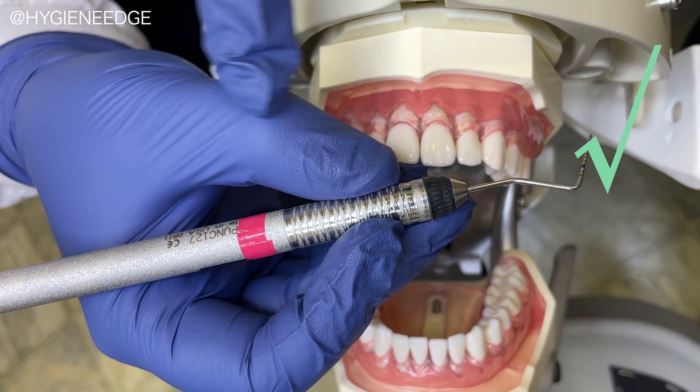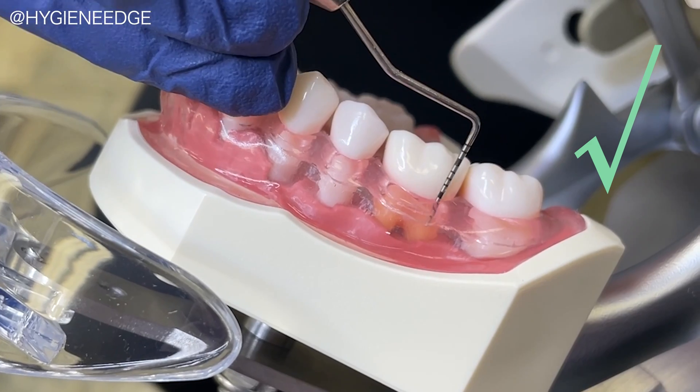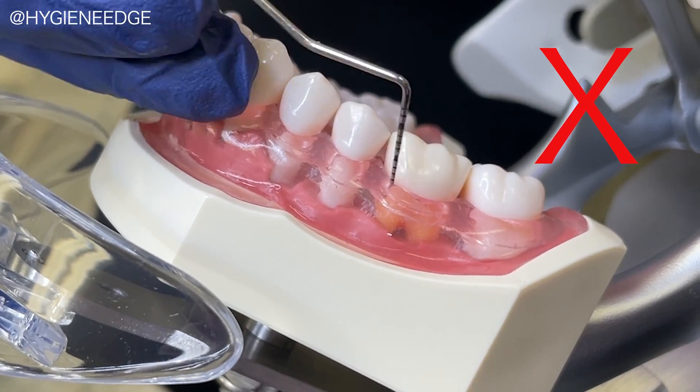Always when you begin probing, use a light grasp versus a pinched grasp to improve tactile sensitivity. It is also best practice to use a one millimeter in length bobbing stroke as opposed to a dragging stroke, like so.